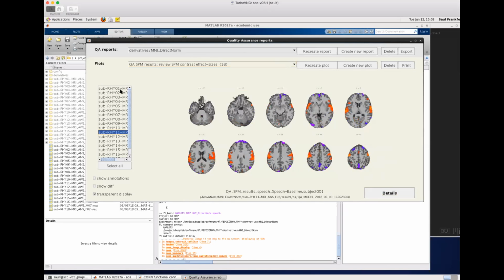So every once in a while you get one like 10. Yeah, that looks too good. This portion in here doesn't look right. I mean, this shouldn't be all that positive, but I don't know. It's like the opposite effect of something.